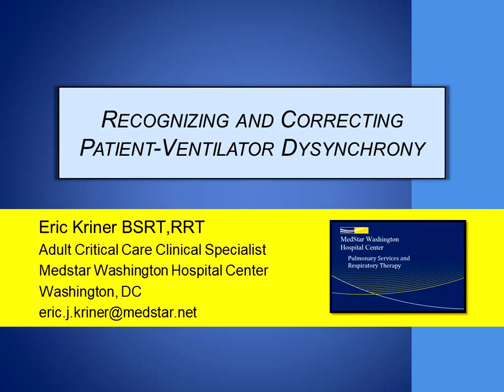So you have to still make sure that you have enough flow being delivered based on the pressure gradient to the patient. Meaning, can you still have inadequate flow or inadequate pressure on pressure-limited ventilation? And I'll just ask this question. Can your patient suck frosties, pull really hard, even on pressure-limited ventilation? And I think that answer is yes. And so in that, it's not just the change in mode. It would be a change in mode and recognizing and making sure that there's adequate inspiratory pressure and inspiratory flow.